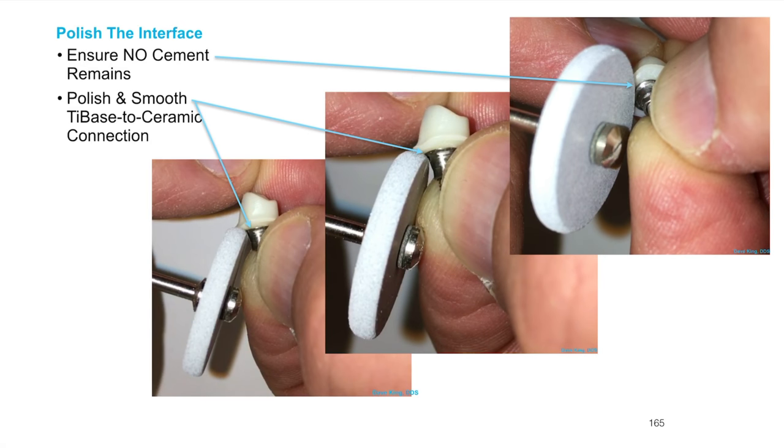We're going to polish the interface using that same Meisinger blue or gray wheel that I use to polish the e.max. I'm going to use it to polish the interface. If I blend the titanium down against the e.max that's totally fine, but be very cautious that you do not damage the area that interfaces with the implant — we need that to be absolutely perfect where the implant interface meets the tie base.